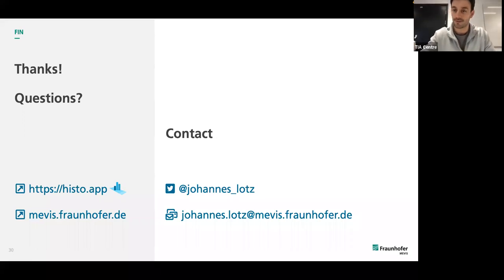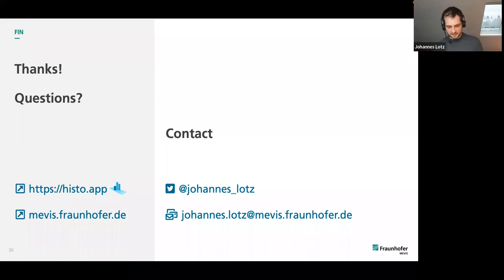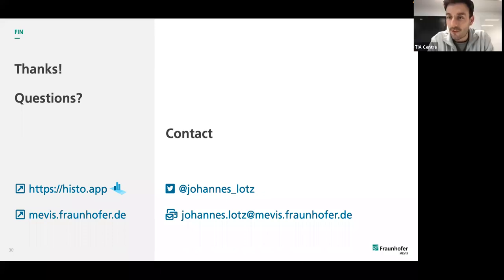A question about automatically quantifying registration quality or slides that could not be registered: you can look at the image distance and deformation energy after registration, but I haven't found a conclusive threshold for when to say it doesn't work. Foldings in the tissue are often a sign that something went wrong. Having a traffic light approach — red when something didn't work and someone has to review it — would be very desirable, but I'm not aware of something that works robustly for this.